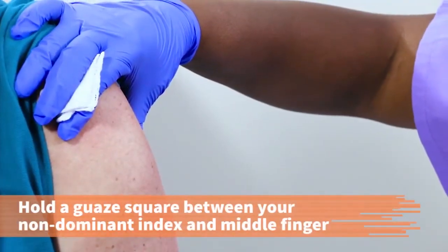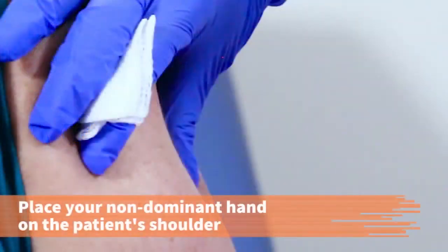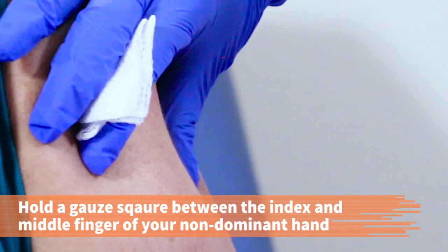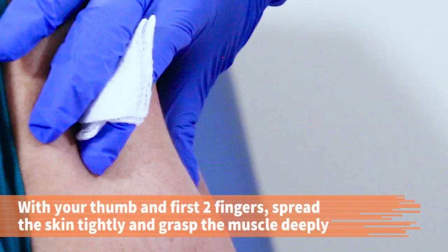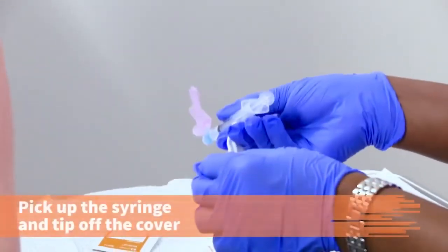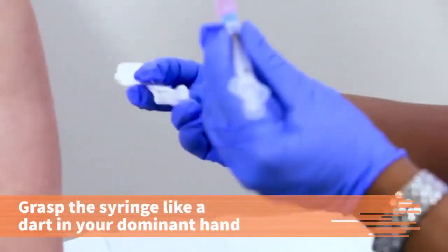Let the site dry. Place a gauze square between your index and middle finger of your non-dominant hand. To compress fat and stabilize the muscle, place your non-dominant hand on the patient's shoulder. With that hand, use your index finger and thumb to pinch up at the cleansed area. With the thumb and first 2 fingers, spread the skin tightly and grasp the muscle deeply on each side. Hold the site. Pick up the syringe and tip it to remove the cover. Hold the syringe like a dart in your dominant hand.